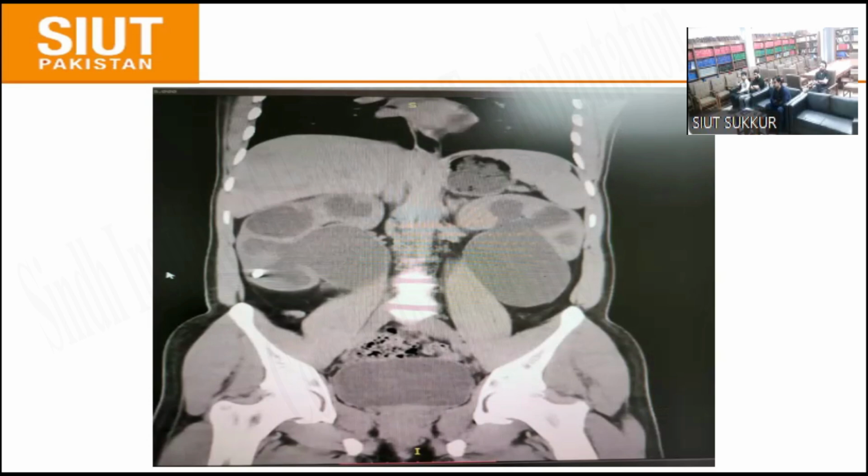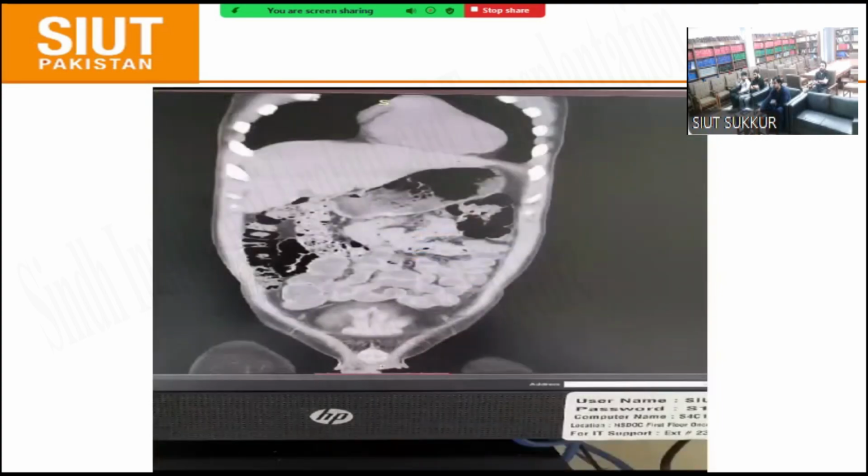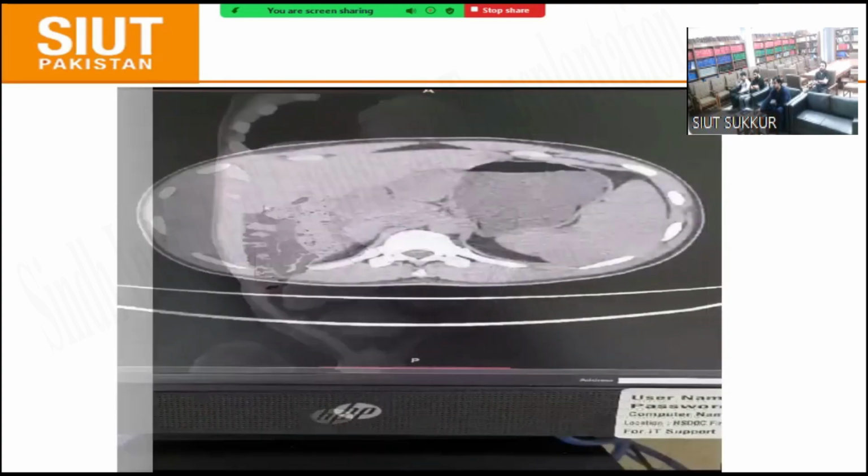Bilateral pyelo and any other finding in the right kidney? So lower pole, non-obstructing secondary stone. So bilateral pyelo, as you can see, pelvic dilatation on the right side. There is significant calyceal dilatation on the right side. Secondary stone, which is non-obstructing.